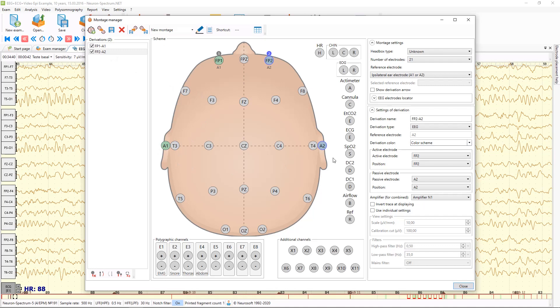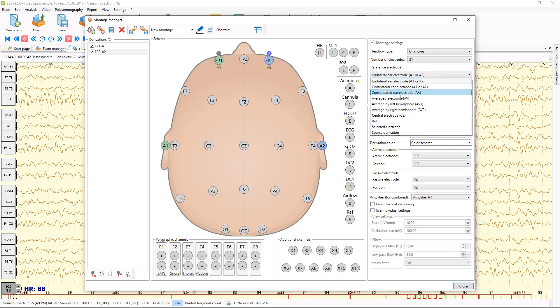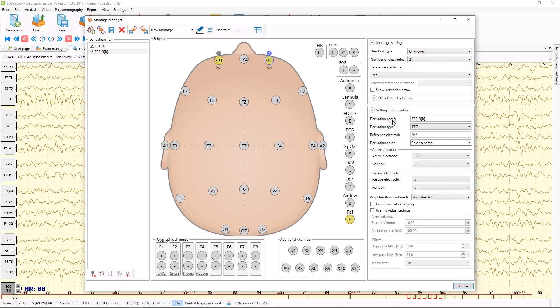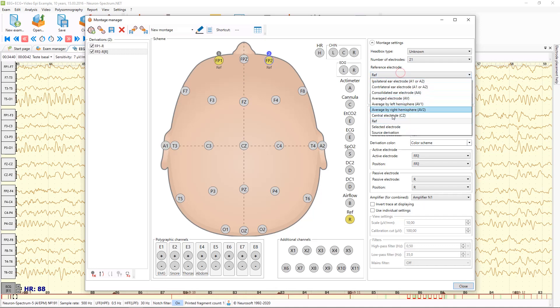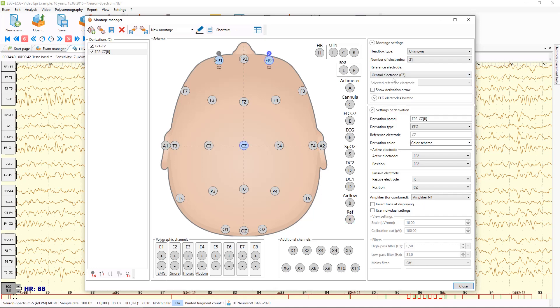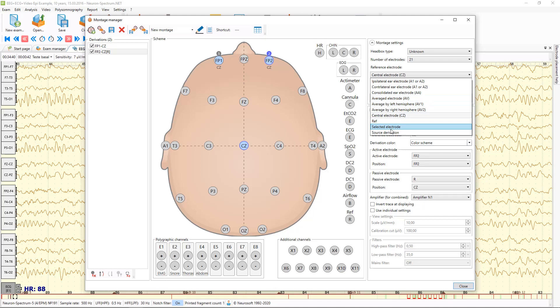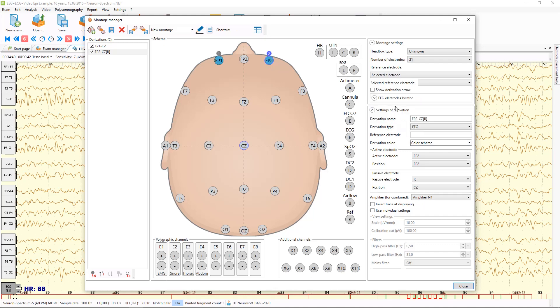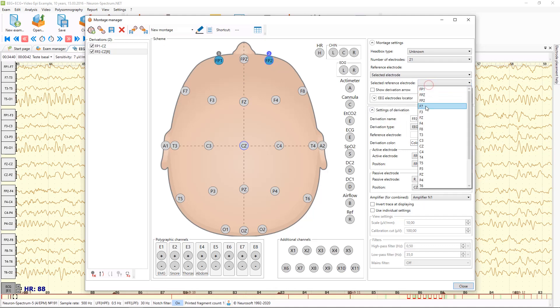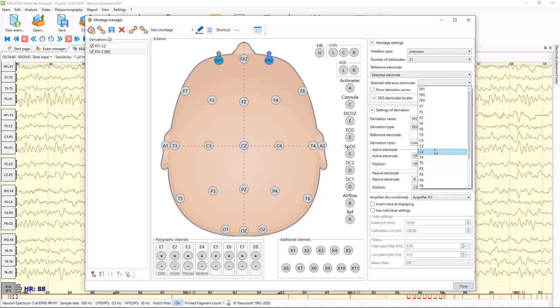Reference electrodes are ipsilateral EEG electrodes by default, but you can select another reference electrode from this list — for example, a separated REF electrode or central electrode CZ. Or you can even select an electrode from this drop-down list. You can select each electrode as a reference.